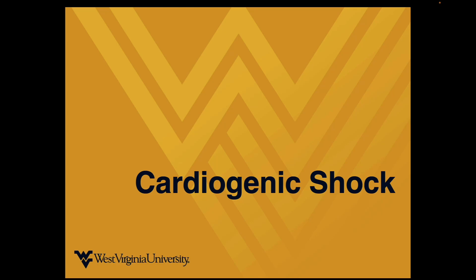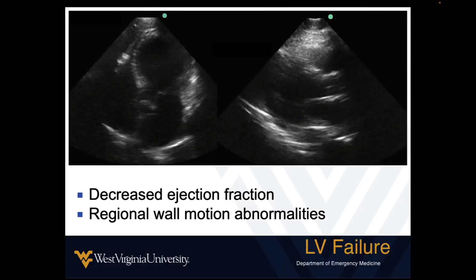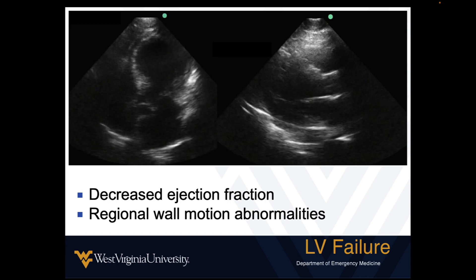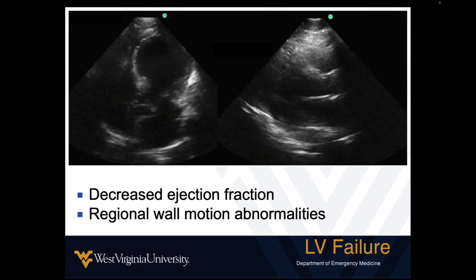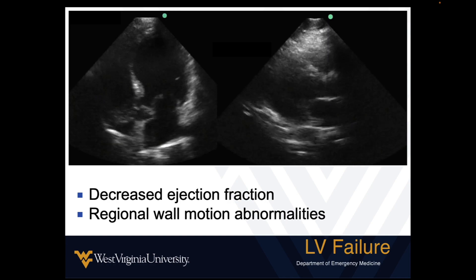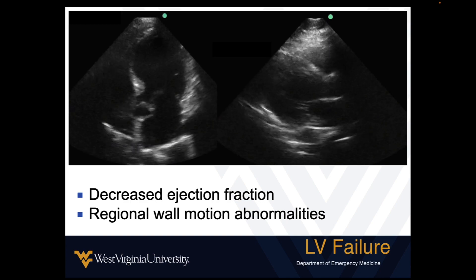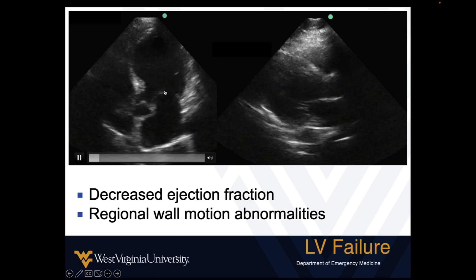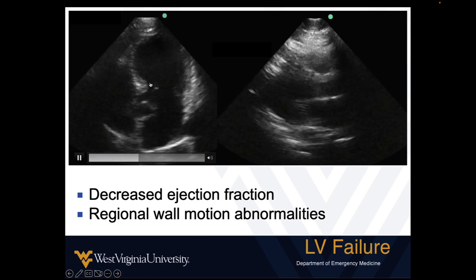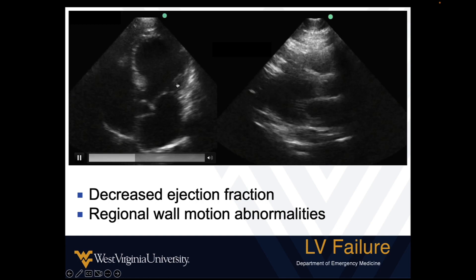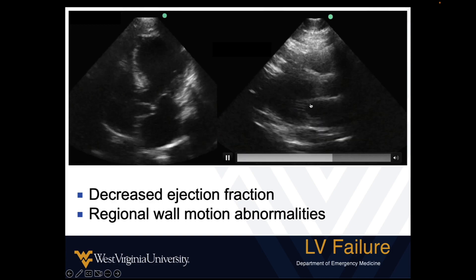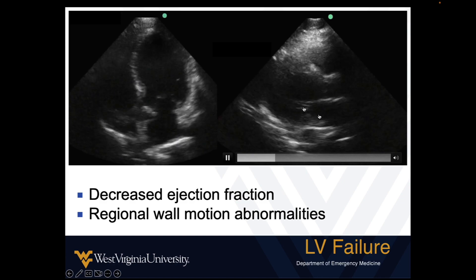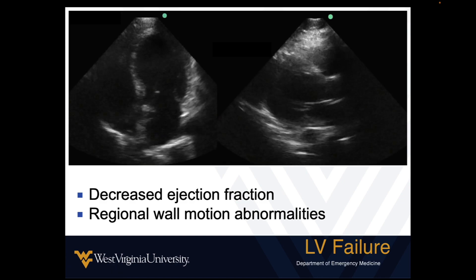How does cardiogenic shock look? Most of the time it looks like this, where we have a decreased left ventricular ejection fraction. Depending on the etiology, if it's an acute MI or some other ischemia, we may see regional wall motion abnormalities. Here we see pretty good systolic thickening of the myocardium at the base of the heart, but the apex is very hypokinetic. Another thing to notice is the mitral valve opens poorly, which is often a sign of poor left ventricular function.